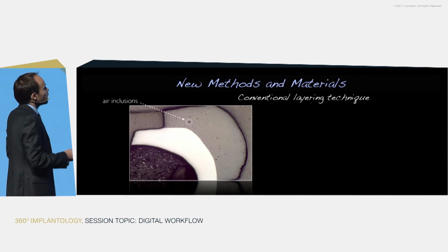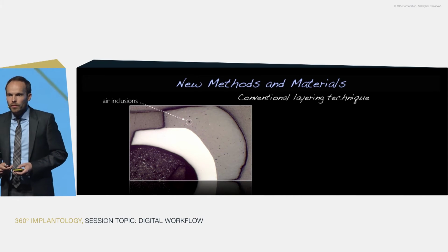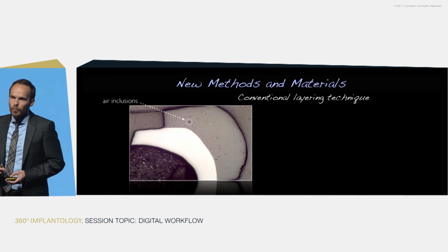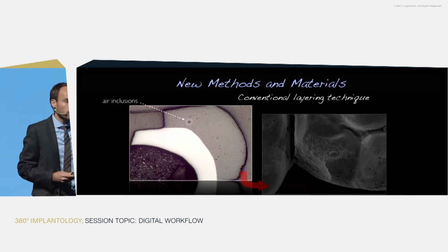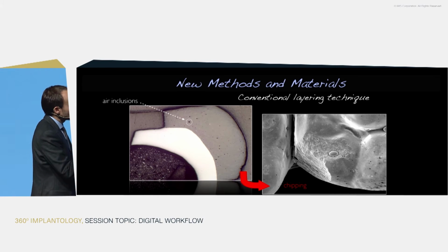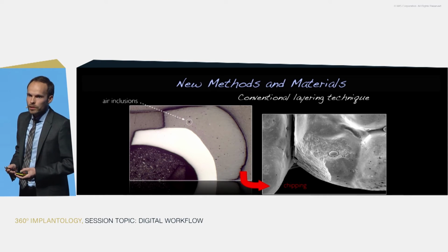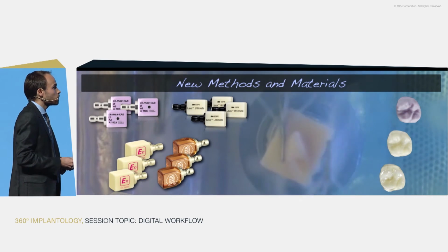put into this. And what happens if you look into some layered reconstruction, here a glass ceramic reconstruction on a zirconia frame, you see these small black dots, and those represent porosities. And these porosities, in summary, besides other aspects like function, can lead to weaknesses within the material, and these are the starting points for many of those chippings.